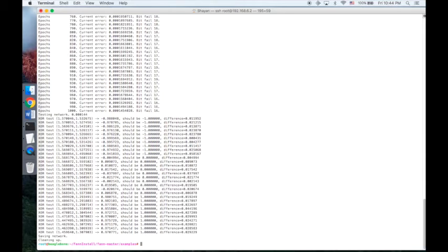Now the system is doing the training, and the training is complete, and here you can see the results, and all the errors are below 0.1, and that is really successful training.